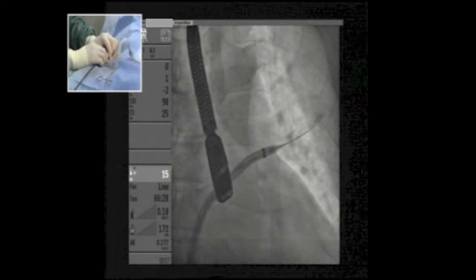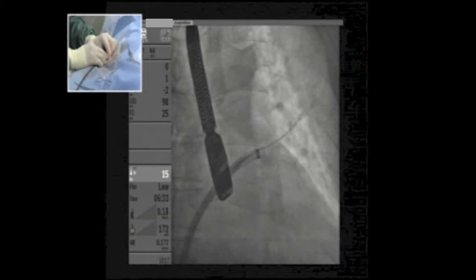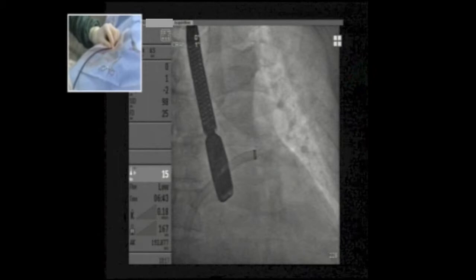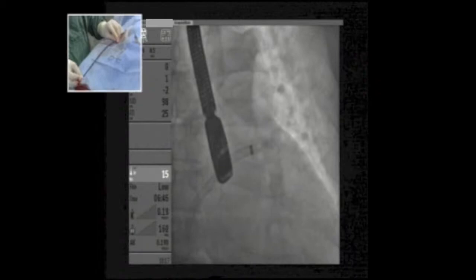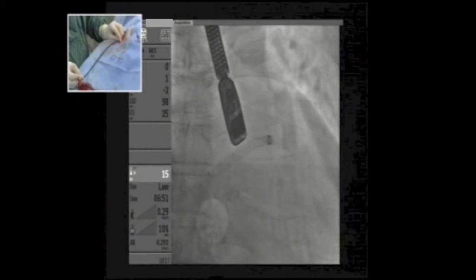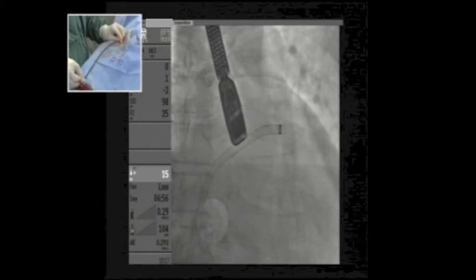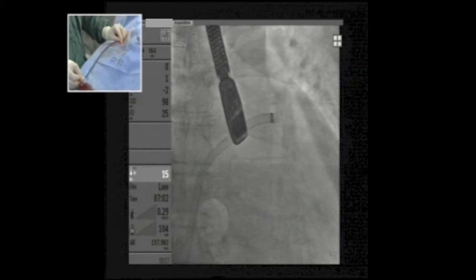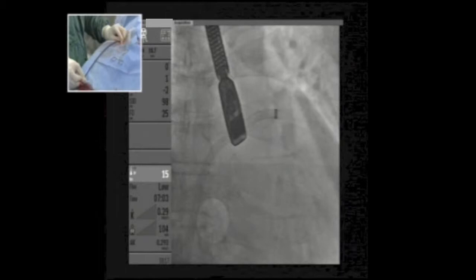I'm removing the dilator and the stiff wire. When we are positioned in the left upper pulmonary vein and pull back on the sheath, we should fall directly into the appendage — especially with a good transeptal puncture, which is the case here. We want to be gentle with the sheath so as not to perforate the appendage. I'm happy with the position, and we are ready to deliver the device.